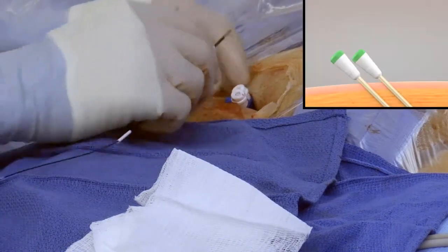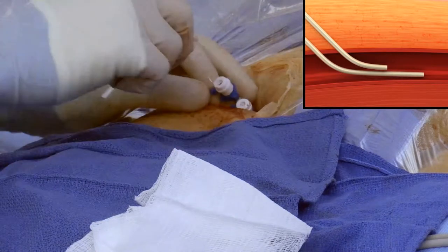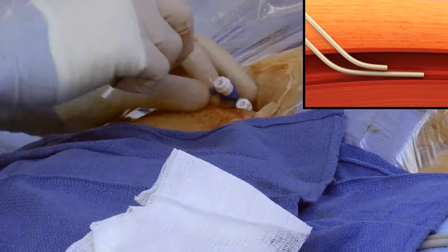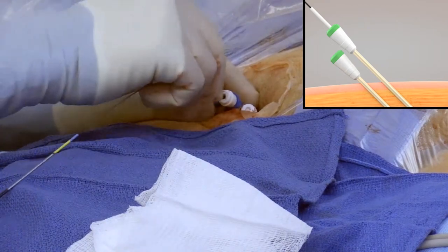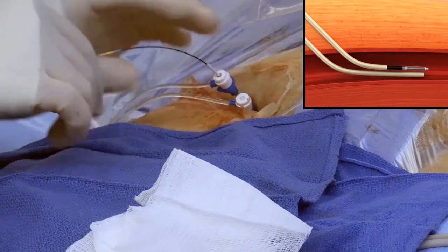Pull the proximal sheath back 3 to 4 centimeters or 1 and 1/2 inches. Care must be taken not to lose vessel access. With short strokes, insert Vascade MVP until the white lock is midway into the hub of the existing short sheath.